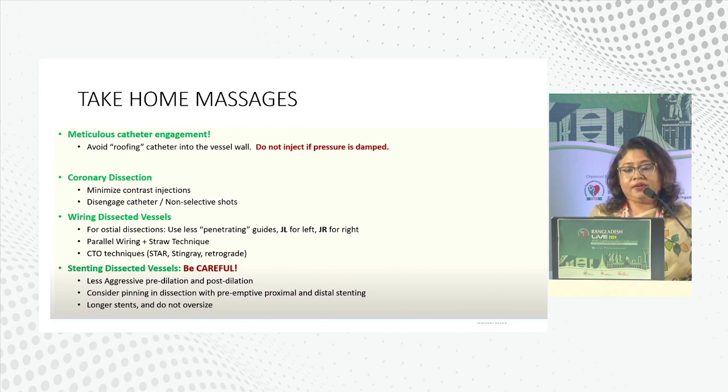Stenting dissected vessels, be careful. Less aggressive pre-dilatation and post-dilatation. Consider pinning in dissection with preemptive proximal and distal stenting. Longer stents, do not oversize.